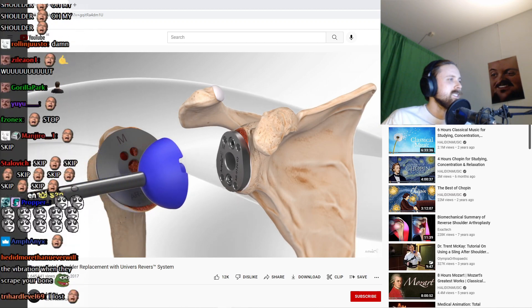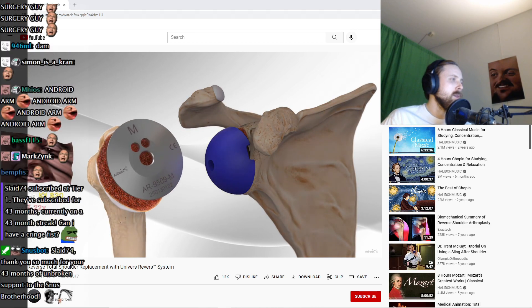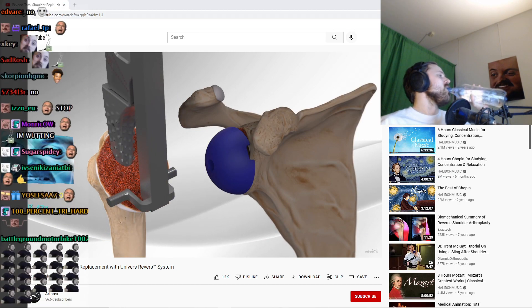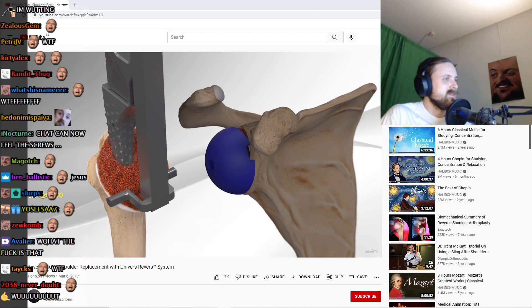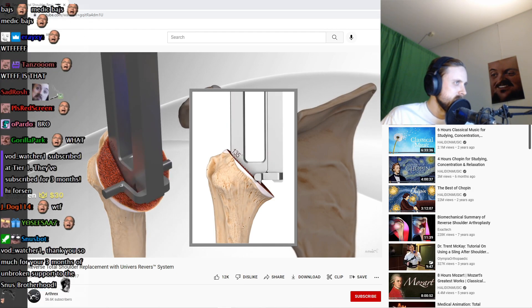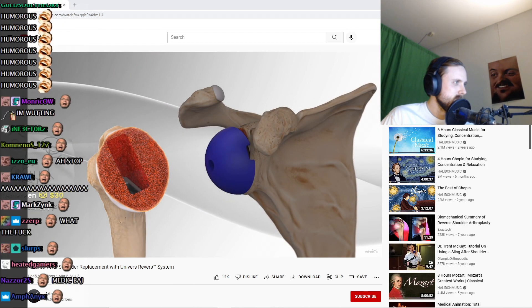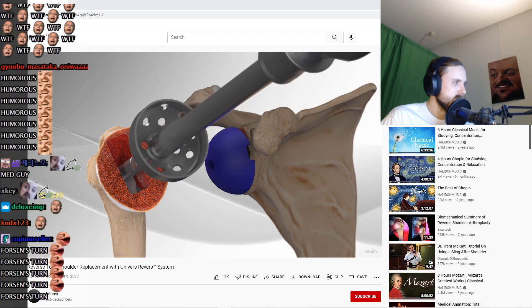A trial implant is placed on the plate to determine the proper size and fit. The metal plate on the humerus is removed and final preparation of the humerus is initiated. Final humerus preparation is carried out by placing a series of instruments down the canal in the bone to determine proper implant size and angle. Once the size has been determined, part of the bone is removed and smoothed out in order to place a trial implant.